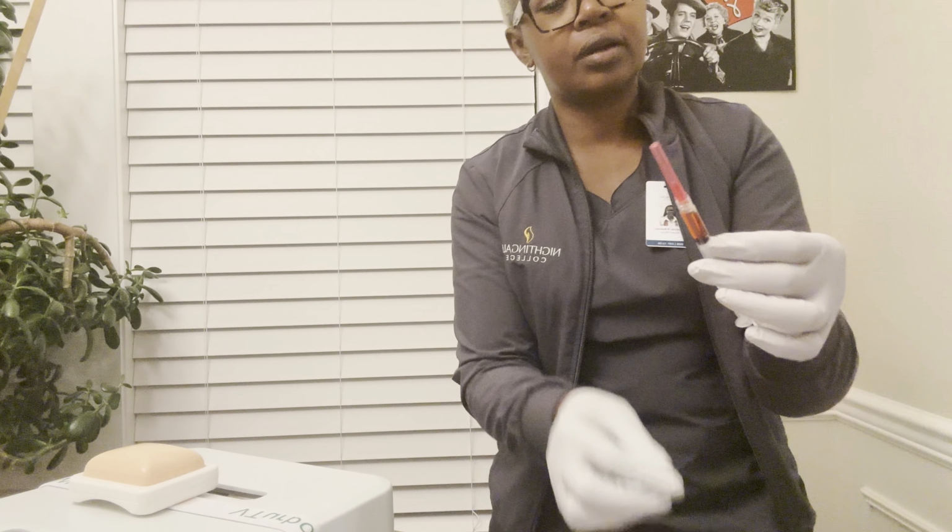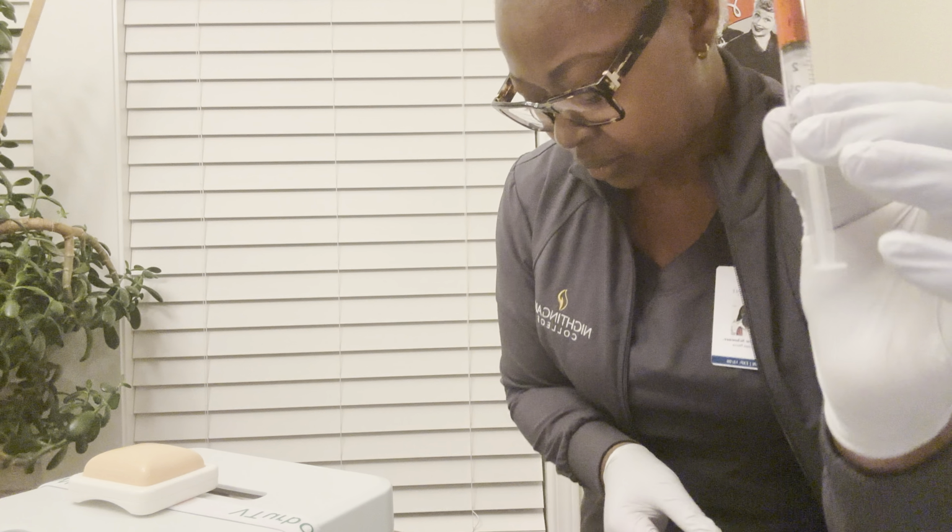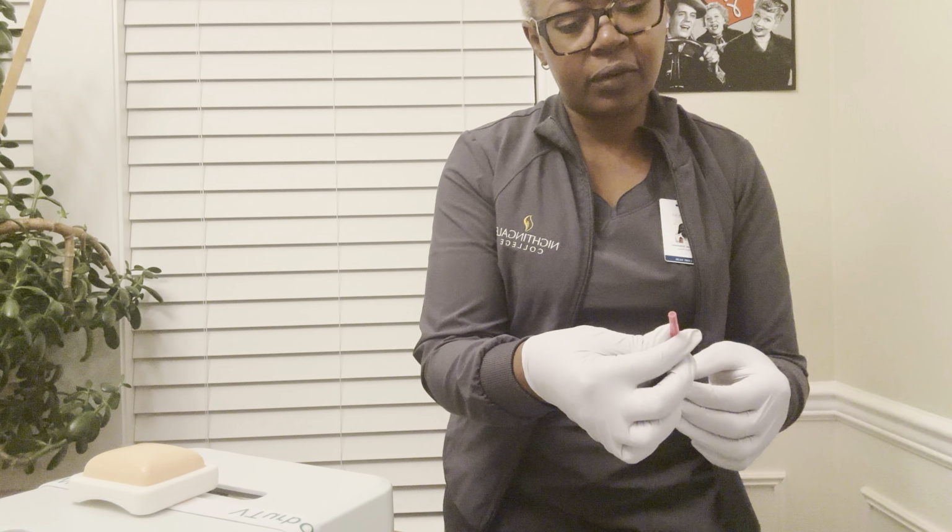I'll show this on camera that I have 1.5 ml of the medication. I'll then go ahead and dispose of this.